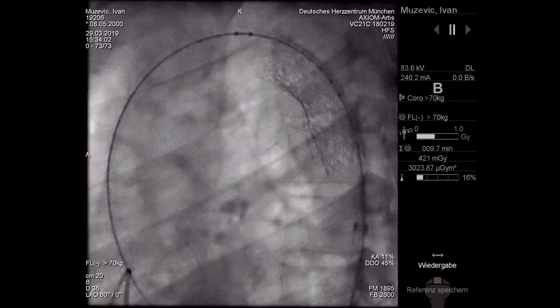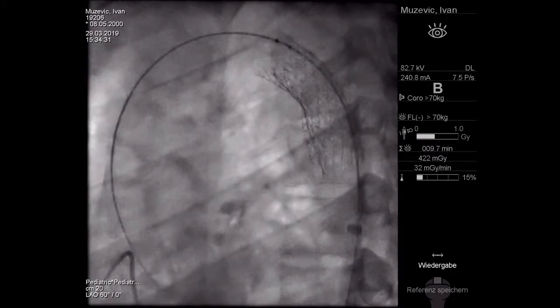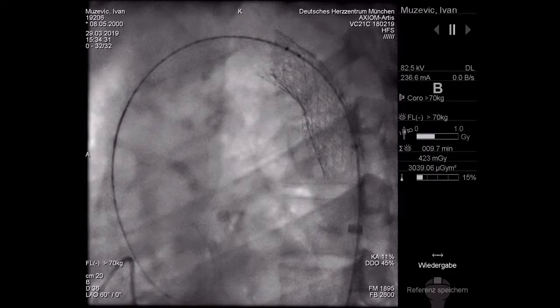Yeah, right. It's a 43 millimeter XXL Andra stent, and I would like to have it a little bit higher up, but I messed it up a little bit with the stent on the balloon, so I'm quite happy that it's now like it is. The only thing we could now think is that we perhaps can take an 18 millimeter balloon, because the alignment in the lower part is not very good.